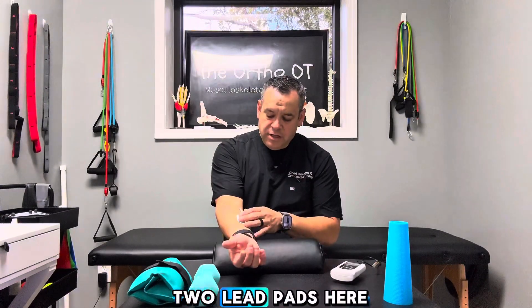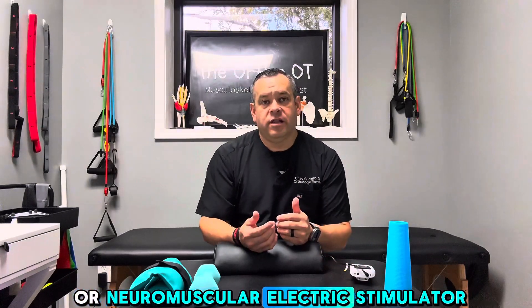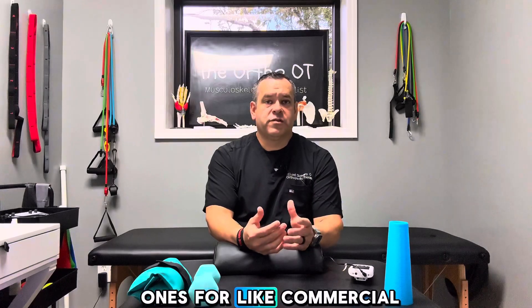I have the two lead pads here on my forearm on the flexor mass. When this kicks on, you're going to see my muscles start to jump. It kind of wants to pull my wrist into flexion, and some of my fingers want to come down. This device is made by Richmar — I like this product. It's both a TENS unit and an NMES, or Neuromuscular Electric Stimulator. It's a really neat tool, pretty inexpensive. I do have the bigger commercial units at my clinic, and they're all FDA cleared. But I like this for portable availability — for patients in the clinic or things they can send home with them to use.